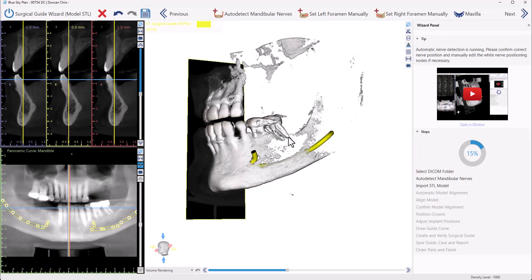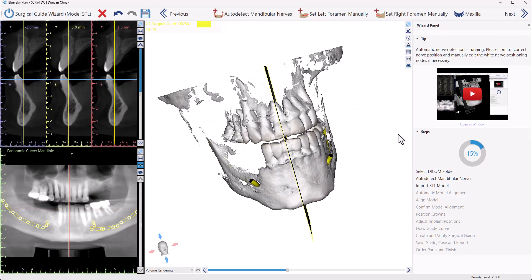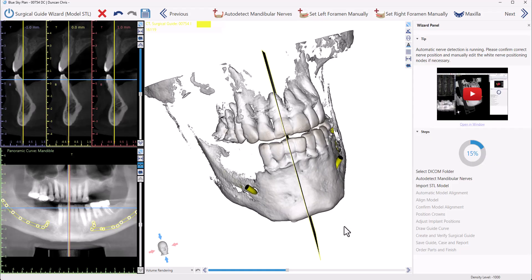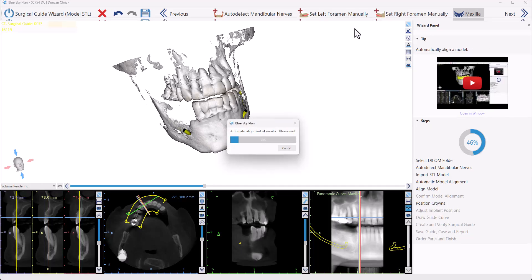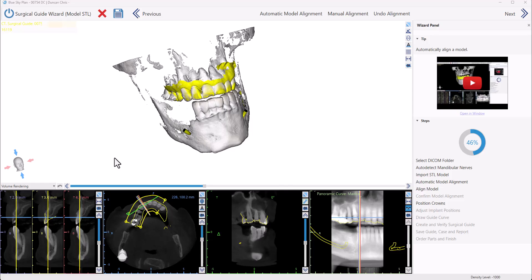The software has automatically identified the nerves. In our situation we're dealing with a maxilla case, so we're just going to click the Maxilla button. The software is now automatically aligning the optical scan to the CT scan. There's no need to select any points or mark any teeth — the process is completely automatic.